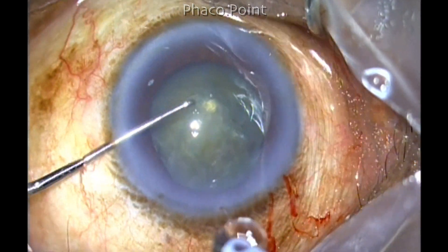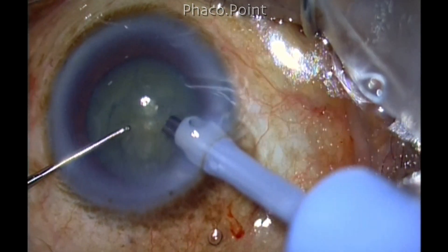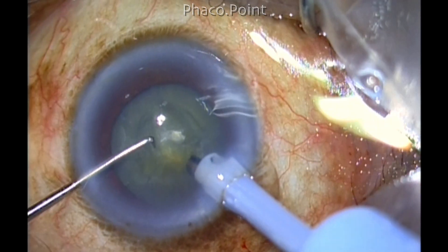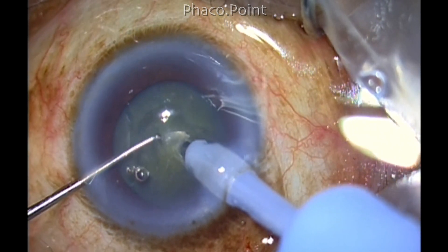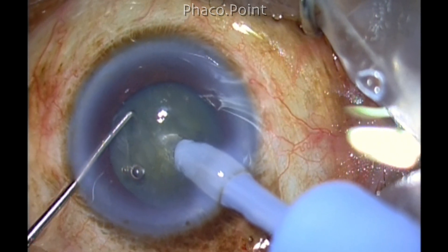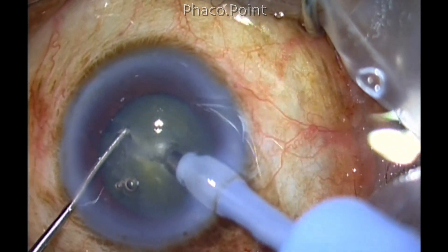Now when you're handling phaco emulsification through a 4.9 millimeter capsular rhexis, make sure that you carry the maneuvers within the capsular rhexis margin and do not stray extremely to the periphery, in which case you may end up slicing the edge of the capsular rhexis.